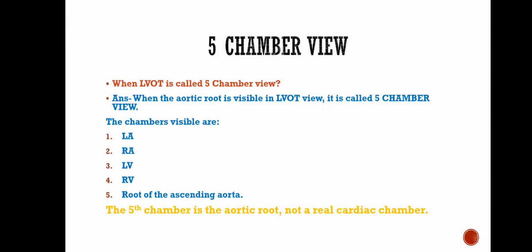Now, five-chamber view. When the aortic root becomes visible arising from the left ventricle, the image is termed the five-chamber view. Although the aortic root is not a true cardiac chamber, its visualization is crucial for confirming normal outflow anatomy.